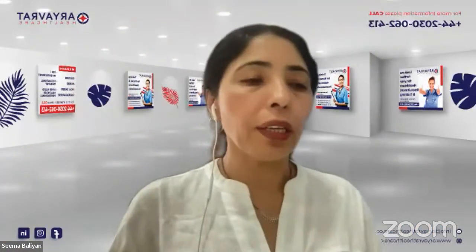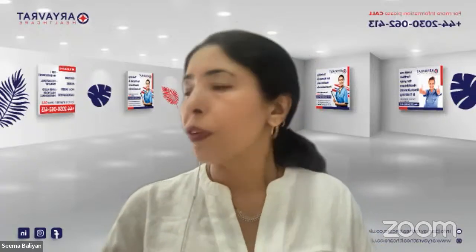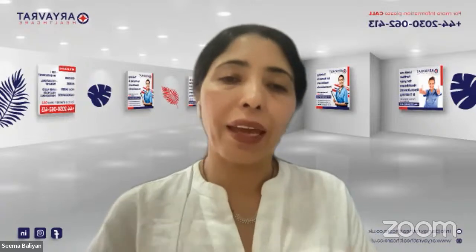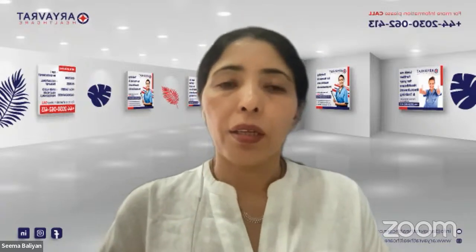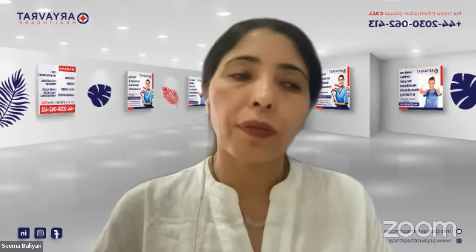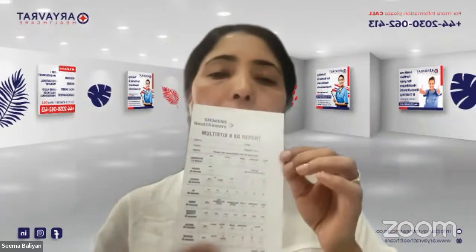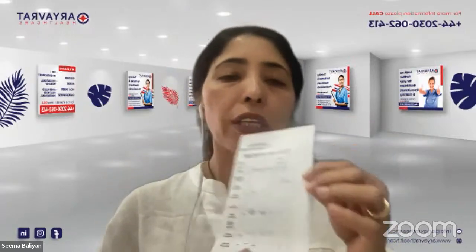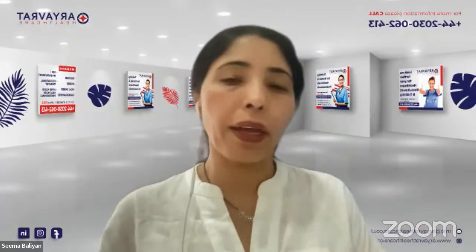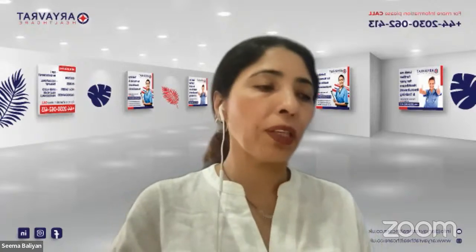Now, what is the other thing that you are going to be using? So we will take gloves and apron, and we are also going to be taking some tissue paper. And we will take a recording paper in which we will need to record our findings. So these are all of the things that you are going to require. Once you have collected all of these articles, you are going to go to the patient side.